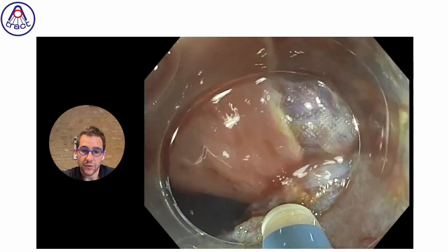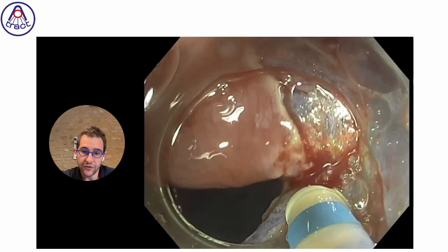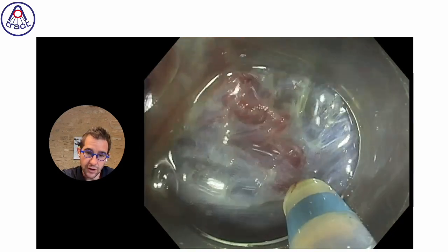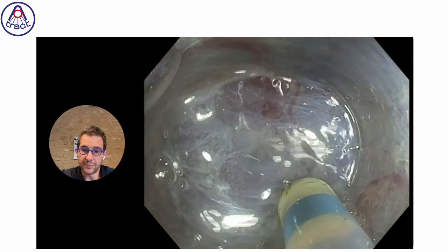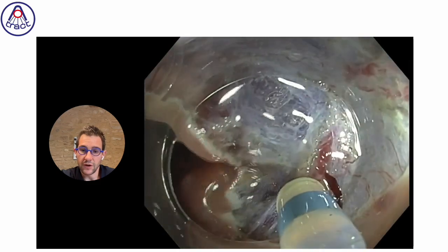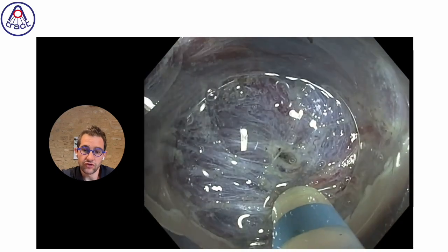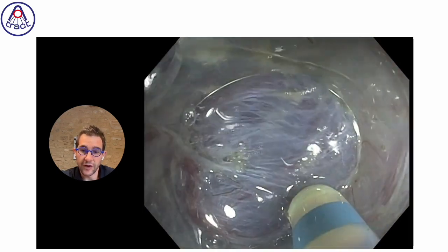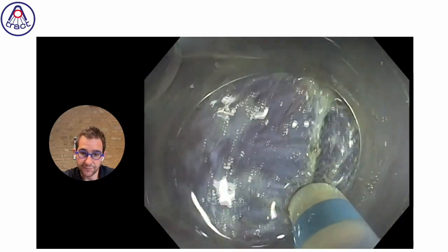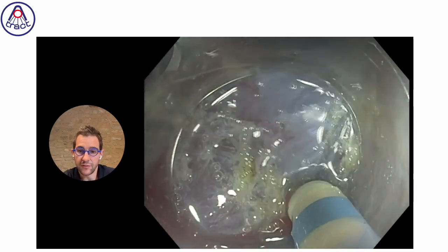So without this kind of device, I should probably perform first the area which is not in the good gravity, so on the down left part of the picture. But here, even if I lose too much, I will be able to tighten the device and increase again the traction. So I choose to do the fastest way first. It means the good side, which is helped by the gravity. So thanks to traction, we can do the easy part first.